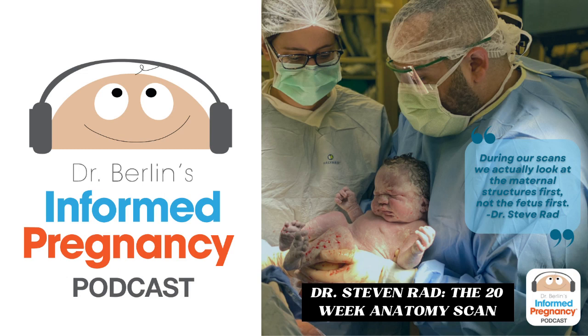Okay, then we move on to the fetus. Part of the fetus, we look at the amniotic fluid volume in the second trimester. You can look at it qualitatively, subjectively, and we all know as we do ultrasound what's a normal amount of fluid, or you can quantitatively measure the amount of amniotic fluid, what we call the single deepest vertical pocket.